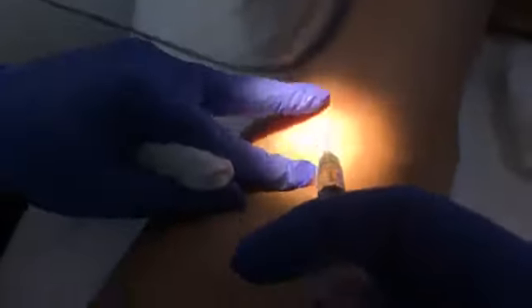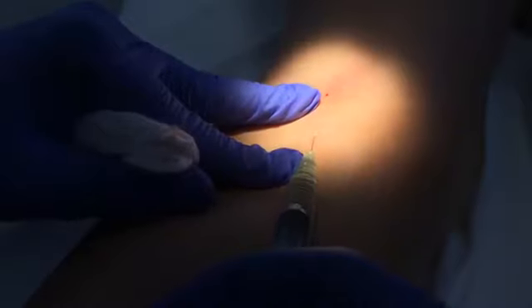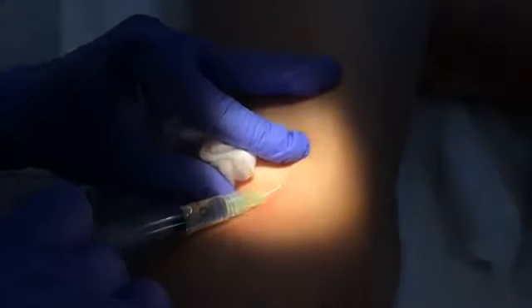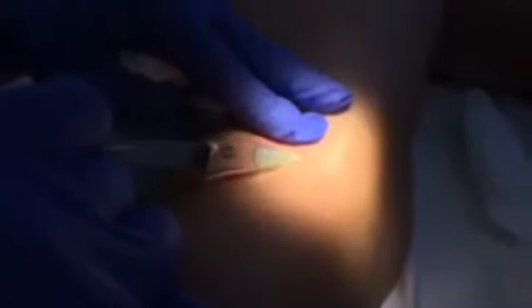Great. So let's go over to here. There you go. Okay, that's getting most of that patch. Are there alternative treatments to this? Yeah, there's laser, but the lasers are more likely to burn, and they're very difficult to use on large areas. So if you have a couple small ones, it's fine.